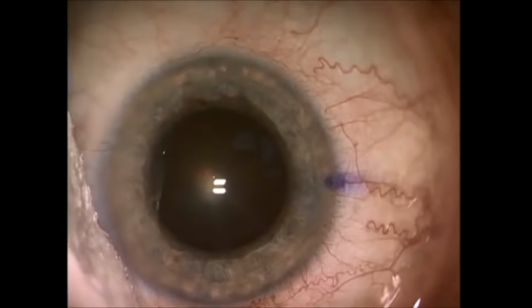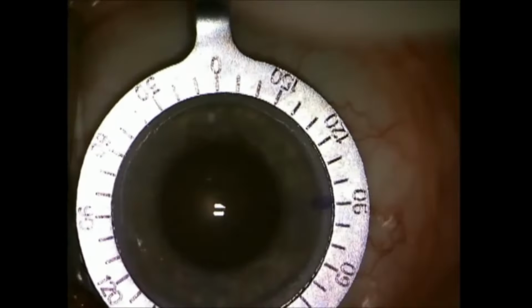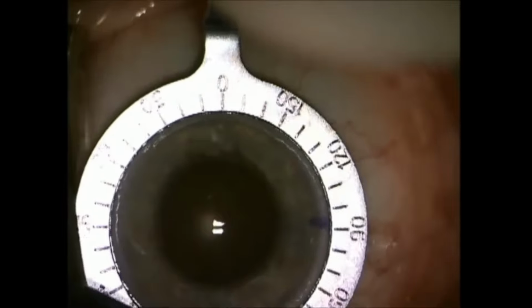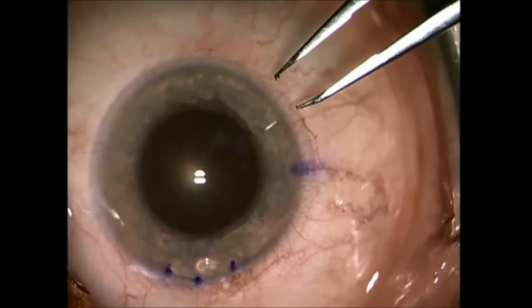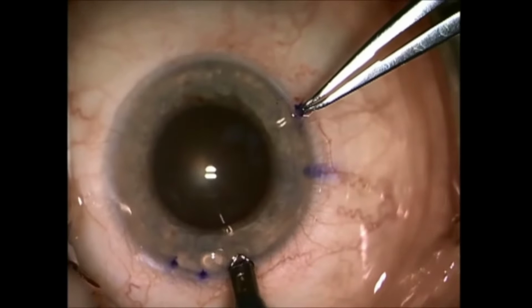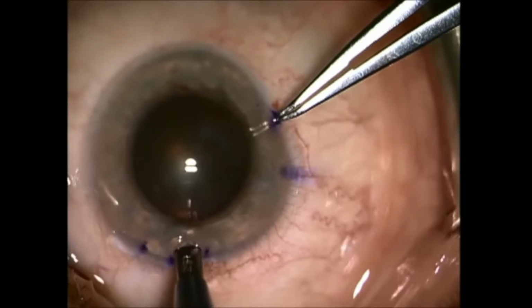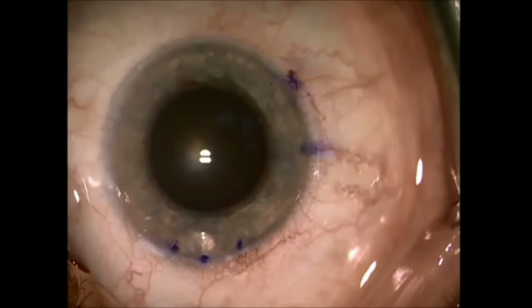It is very important to dry the surface of the eye before you mark, otherwise the ink markings can run. So I use a Weck-Cel sponge and I use a Mendez ruler. There are many different ways of marking. One isn't better necessarily than the other. And in this case, I use an inked caliper to mark my 3 dots, my arc that I'm going to connect with a diamond blade that's preset. I go in perpendicular to the cornea and in one gentle move, drag the LRI blade and connect the 3 dots and then remove, and the LRI is done.